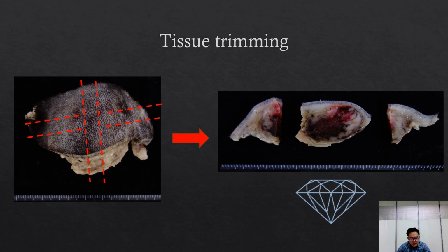So with that, we will probably be able to diagnose what it is, because we got a nice chunk right through the middle, and also assess if the tumor extends to the deep edge or to the lateral edge right there, because it's going to be important for what the clinician might want to do next.